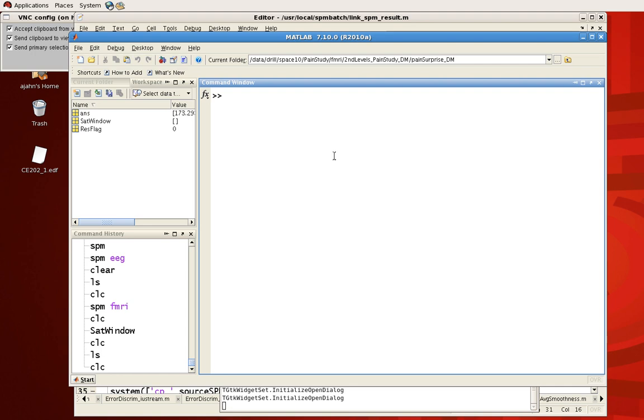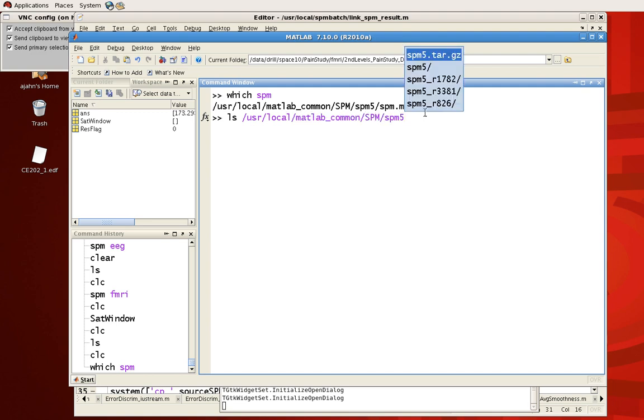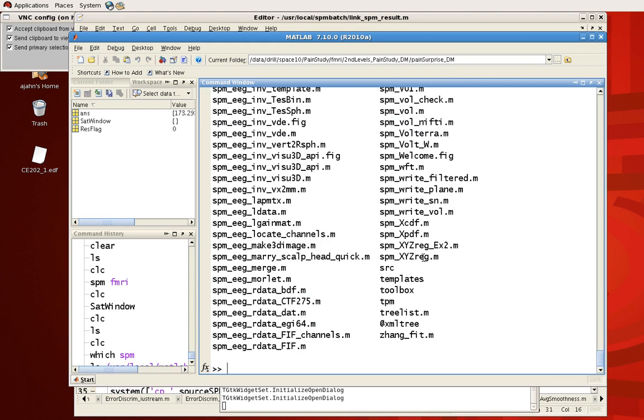In other words it doesn't matter what directory you're in, you can type in any SPM command and it will execute. So to show this we can type which SPM to see where the SPM command is and ideally it should be with all the other SPM commands in the SPM library.